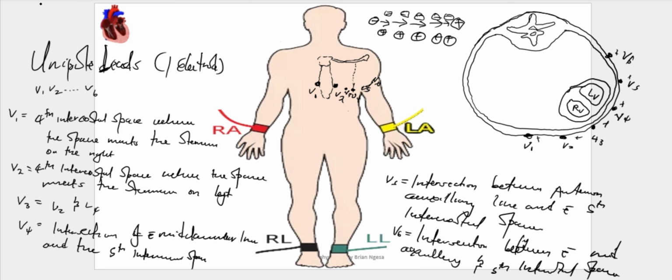So we are only able to give the ECG graph based on the electromagnetic field created by the electrodes that gives us deflections or an isoelectric line, based on how they correspond to the normal electrical movement of electrons, based on the electromagnetic field created by the negative and the positive electrode.